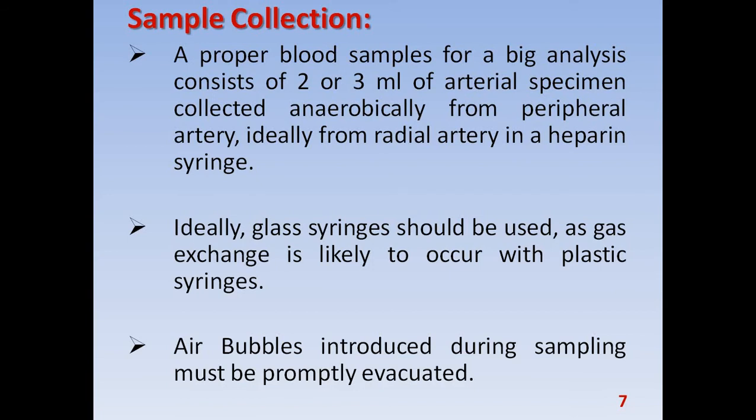That's why it is not indicated. When the Allen's test is negative, ABG is not indicated, accurately in a negative modified Allen's test.